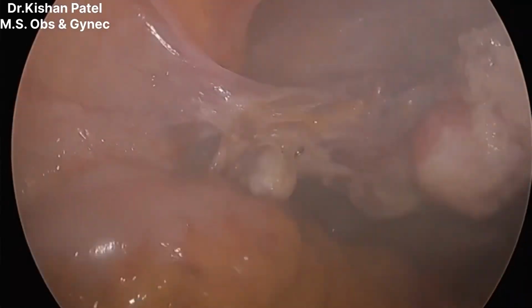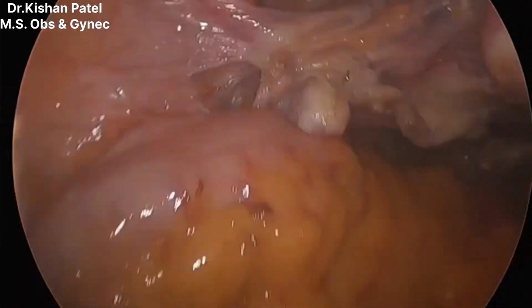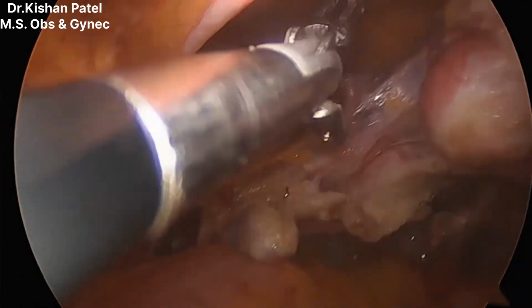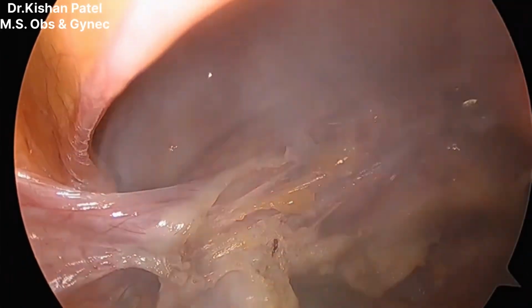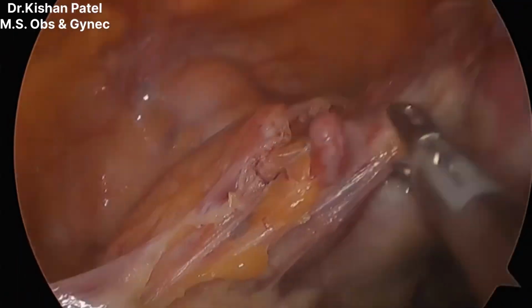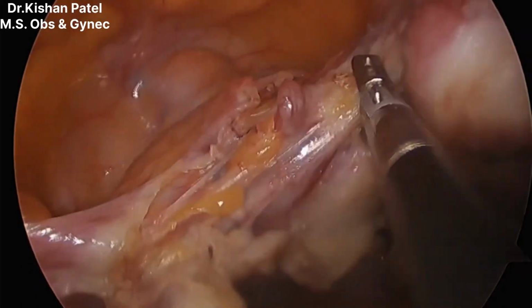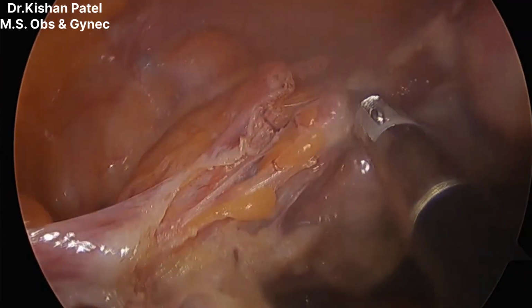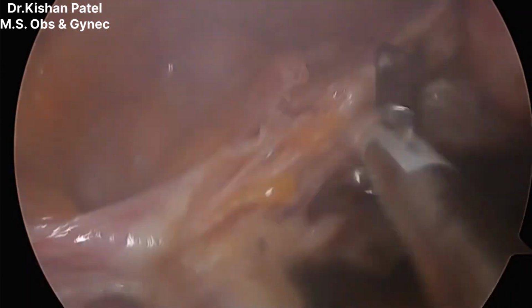Now we are coagulating the uterine vessels on the left side as well, so we can cut on both sides. We are coagulating both of them, left side uterine artery and vein.